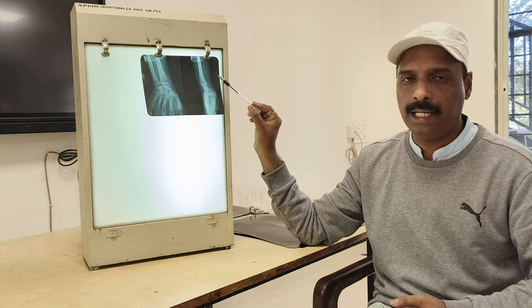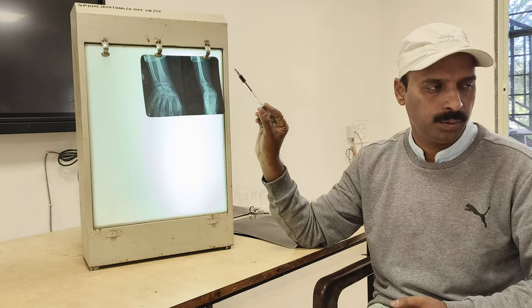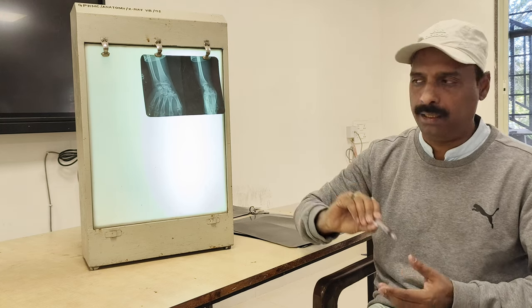This is one lateral and AP view of the wrist joint. So this is the plain variety of x-ray.